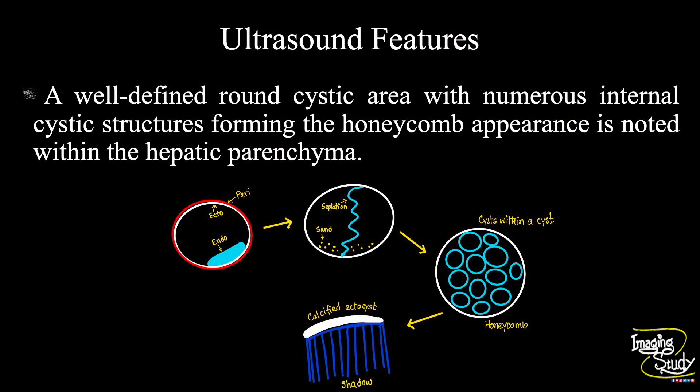In summary, a well-defined round cystic area with numerous internal cystic structures forming a honeycomb appearance is noted within the hepatic parenchyma, indicating the infective state of hydatid cyst.